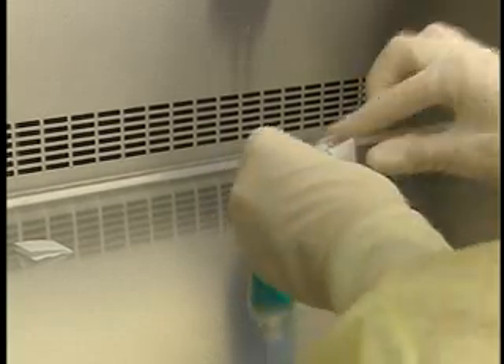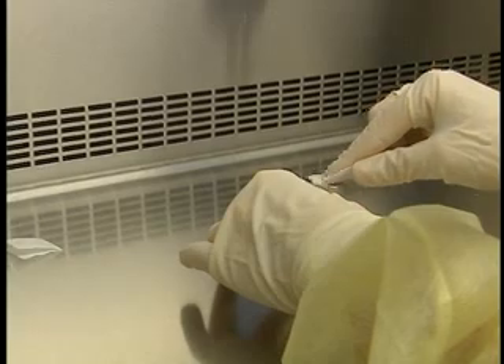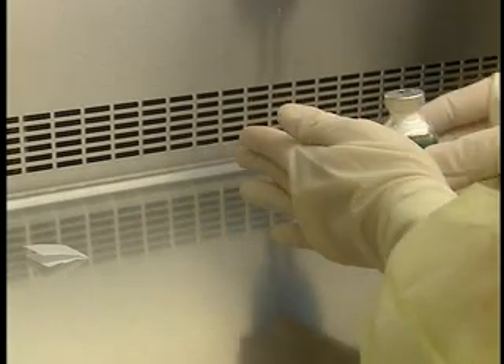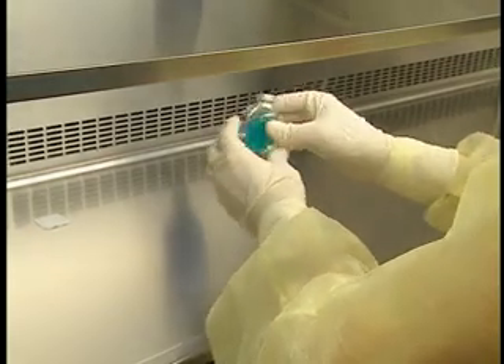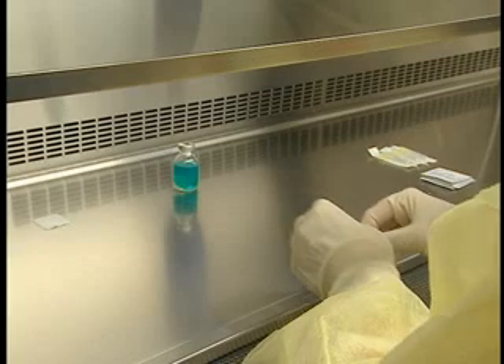If there is any liquid on the vial stopper, wipe it with an alcohol swab. Shake the vial if the medication permits, with a gentle circular motion. Wait until the product is completely dissolved and the foam has disappeared before withdrawing from the vial.